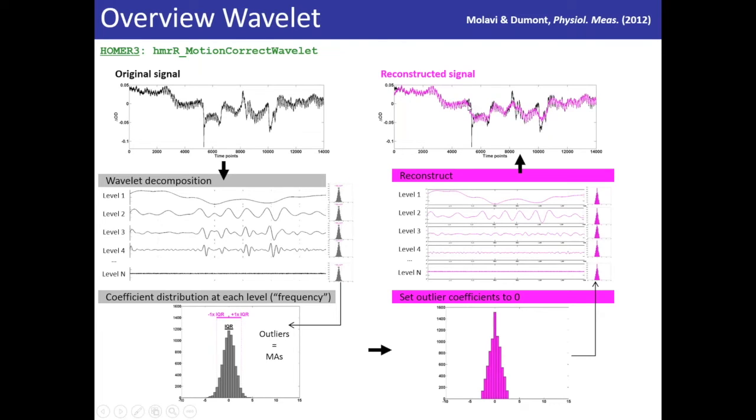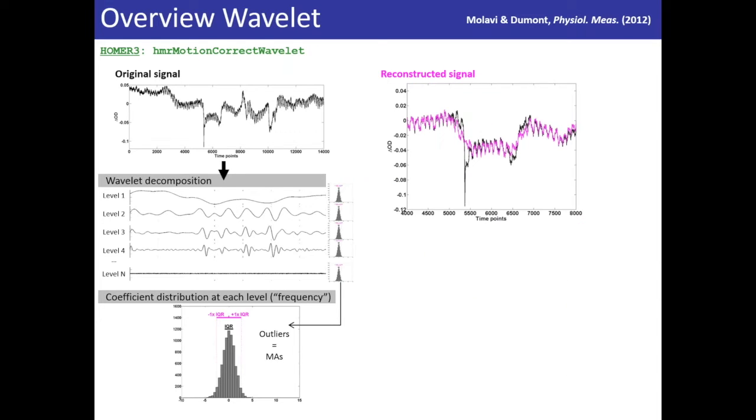So this motion artifact actually consists of both a baseline shift. Here, the signal level is here, and then it goes here. But there's also a spike. Spike is perfectly corrected, but there is still this change, this offset that is not corrected. So it's really good in spikes, but maybe not that much in baseline shifts. So here is the reconstructed signal. Closer look.